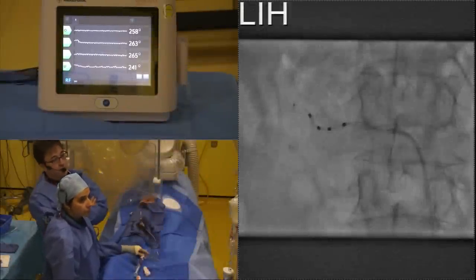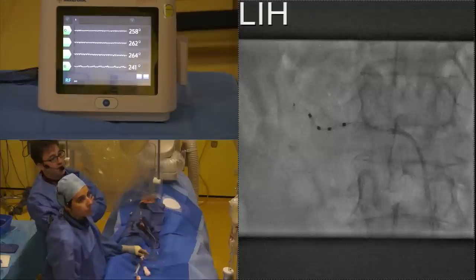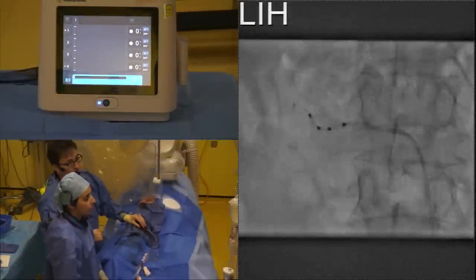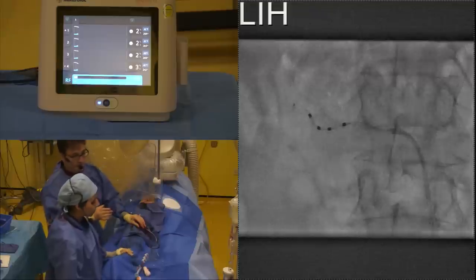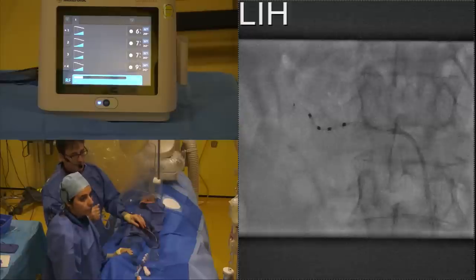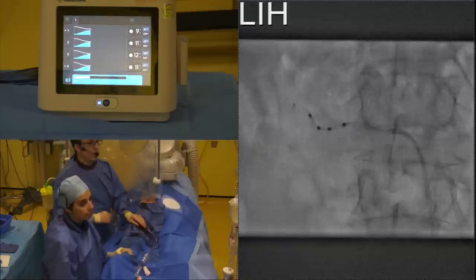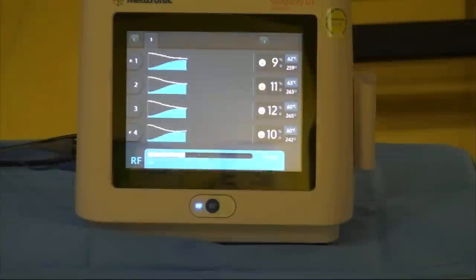In this patient we've got nice flat readouts again. Maybe the bottom run there's a little bit of movement with respiration, which you can see it's phasic and repeatable, but the values are slightly higher. It doesn't necessarily mean anything, but it does vary from patient to patient. I'm going to go ahead now, Hydron, if you could go ahead and do this ablation for me. So we've started the procedure. I pre-medicated this gentleman. He's a larger gentleman and he was not completely asleep with 2.5 of midazolam. So I've given him 5 of midazolam and now he's had 5 of morphine as well.